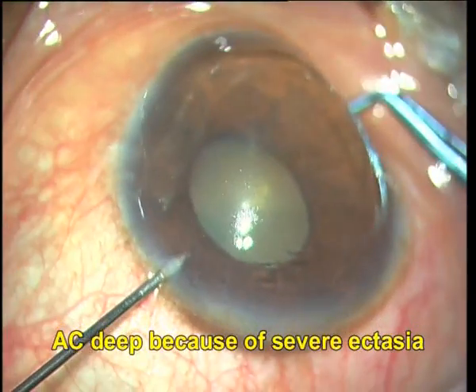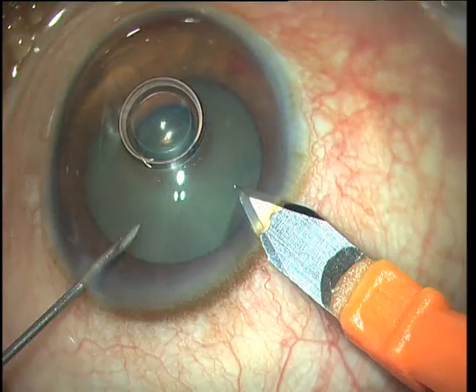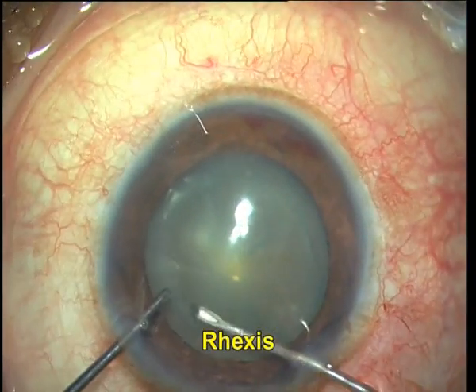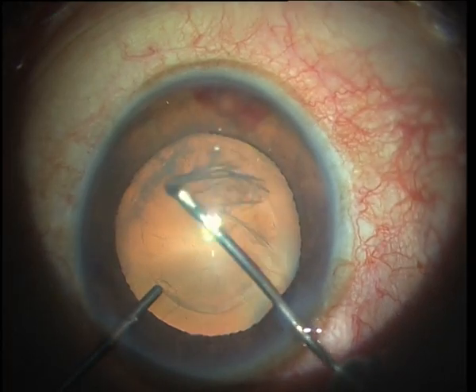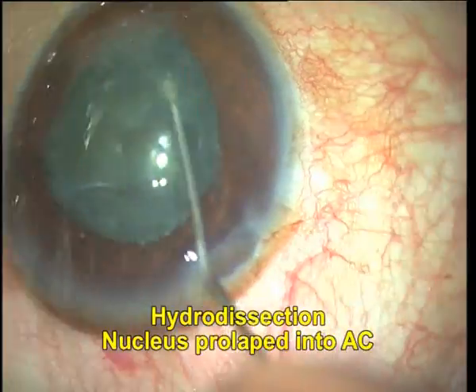This shows an ectatic zone of about 9 mm. You can see that the AC is quite deep because of the severe ectasia, and therefore phacoemulsification is going to be slightly tough. I have made the clear corneal phaco incisions and I am doing a rhexis. You can see that there is some amount of spontaneous bleeding from the angles of the anterior chamber without any inciting factor.